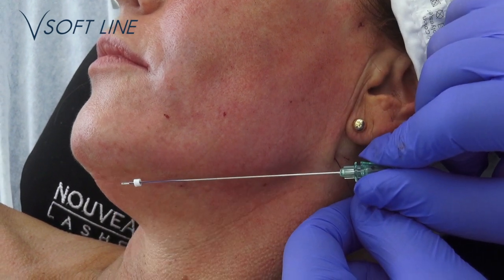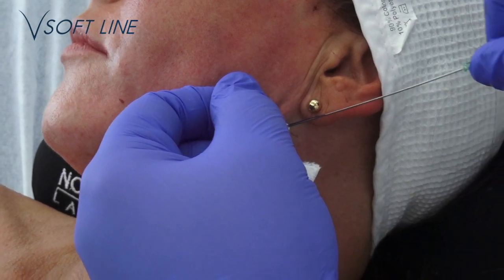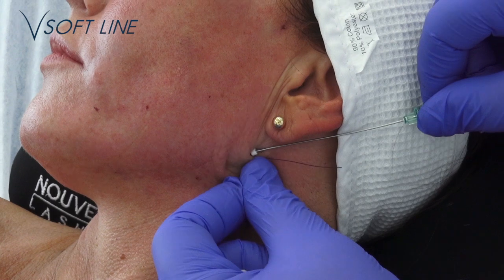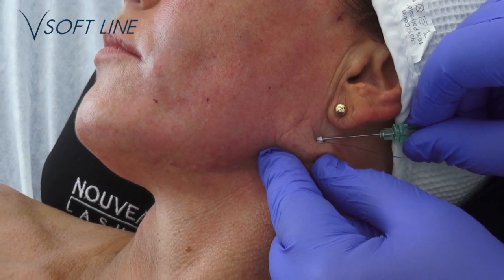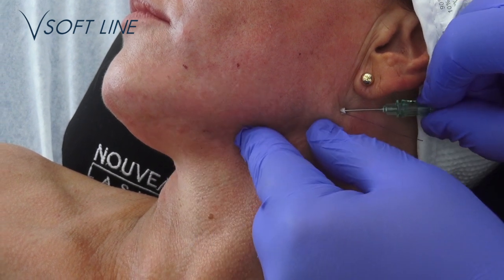Proceeding with the second one. It's located just below the mandible edge. Pull out the needle here, to avoid that the sutures get tangled in each other, like a fishing net. It's like when you go fishing with several rods. Those of you who know what it's like when fishing. You watch carefully how the lines run.